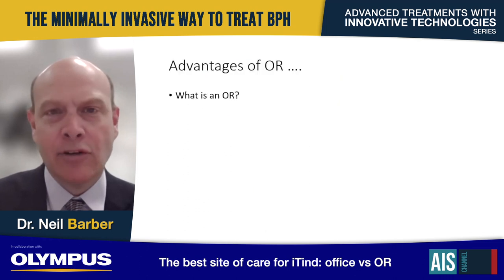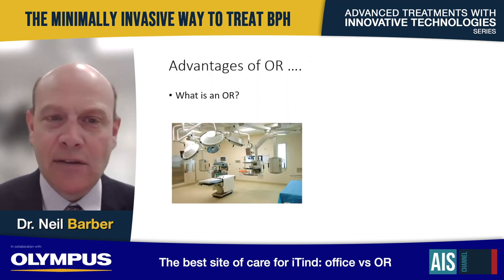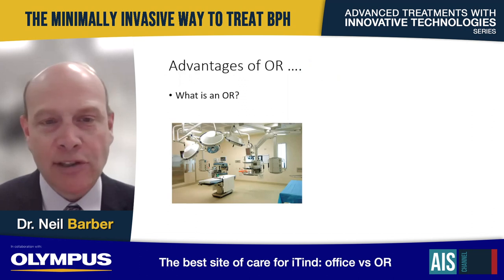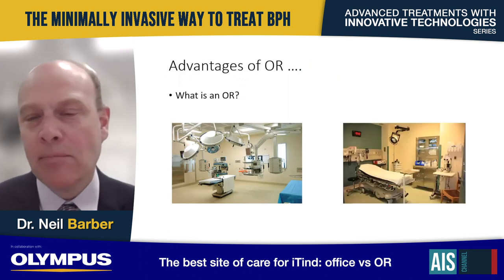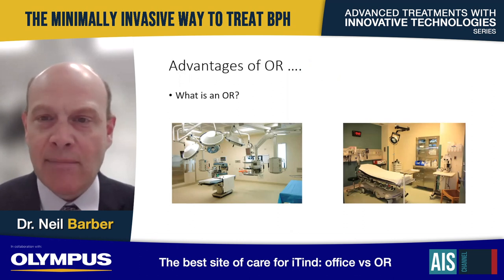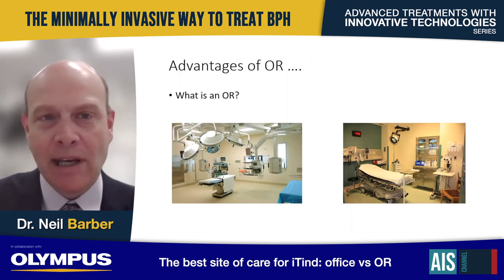But what is an operating room? Well, it doesn't have to mean delivering and positioning the device in an operating room where one might be doing major surgery or robotic assisted surgery. That can still mean a minor operating room, which is where I tend to perform the procedure, therefore relieving pressures upon a standard operating theatre and still creating a very ambulatory experience and setting.